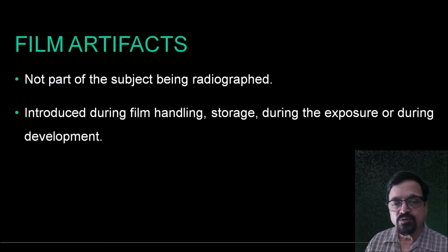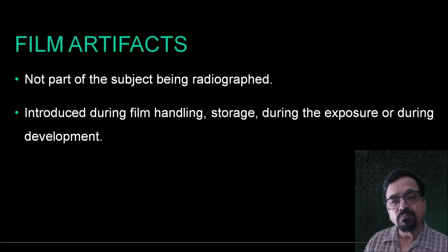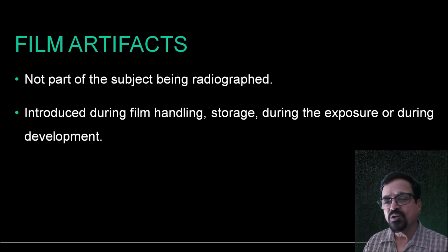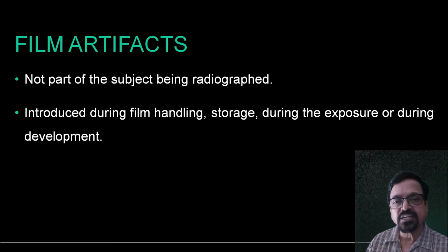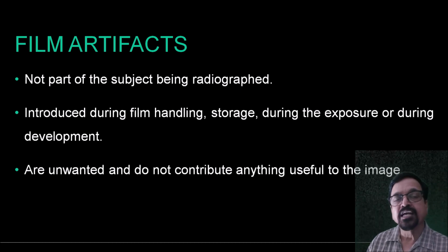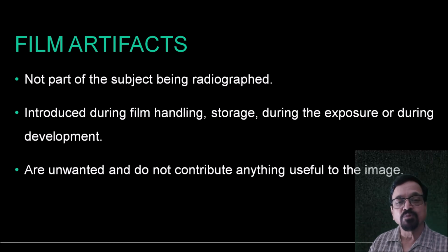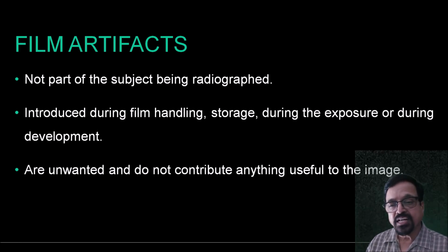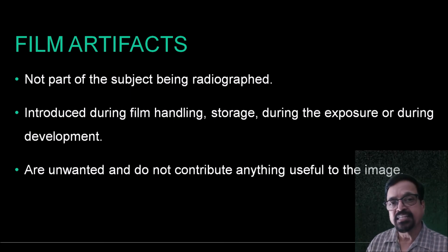Now, this can come from bad handling, bad storage, or during the exposure, or during the development. So during the processing time, during the storage time, during the handling time, during the transportation time, everything is important, including the place where you store a large number of films. They are unwanted and they often cause more problems because they need to be interpreted, and they should not.